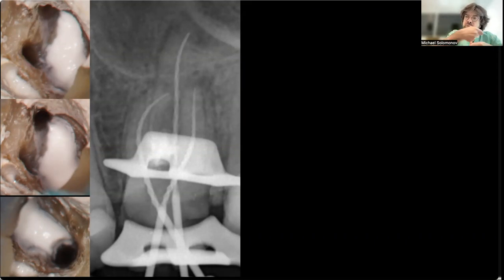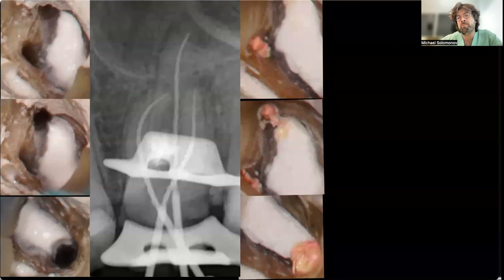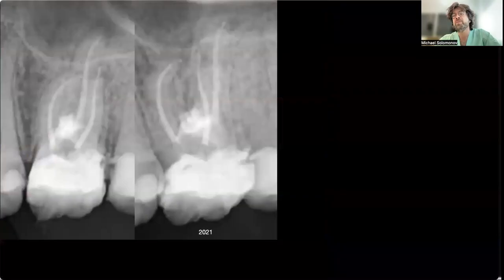Now you see again the X-ray with my instrument, to check that I didn't push some BC Putty inside the canal, and you can see the BC Putty in the area of perforation. After that I finished my treatment with gutta-percha and BGM root canal sealer, an interesting epoxy sealer with a macromolecule that prevents biofilm formation. I put glass ionomer and my temporary filling, and I gave a strong recommendation to the dentist to finish with a post-endodontic restoration without a post, and to put a crown.